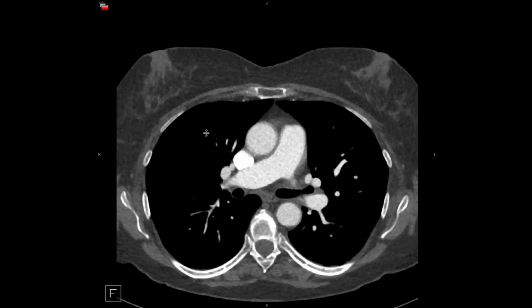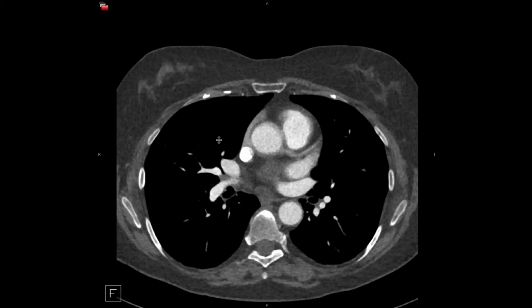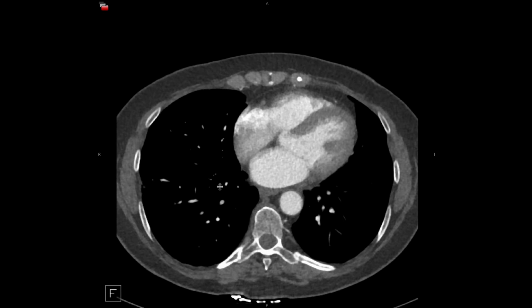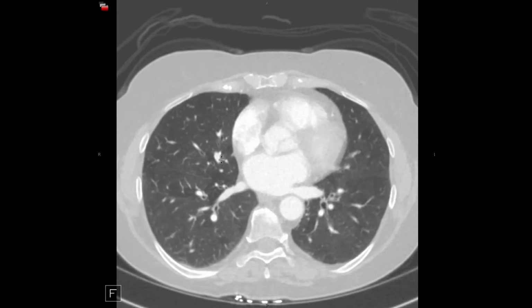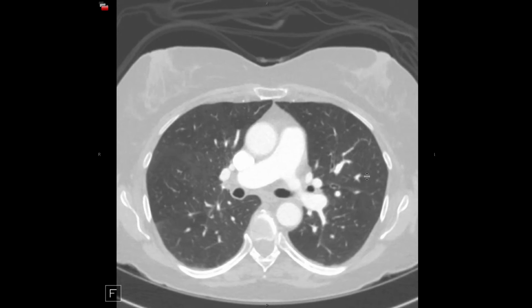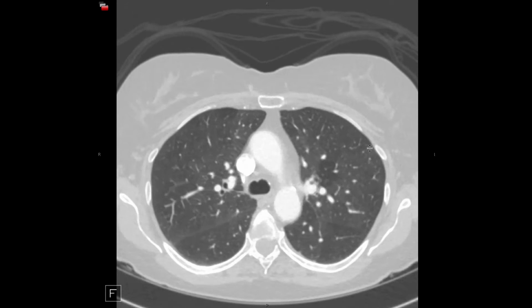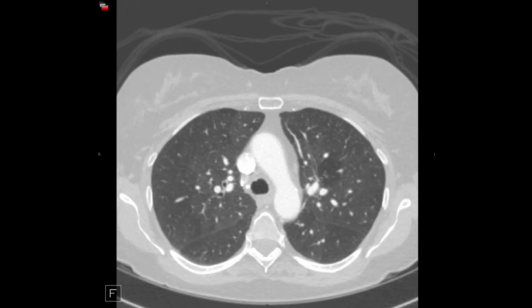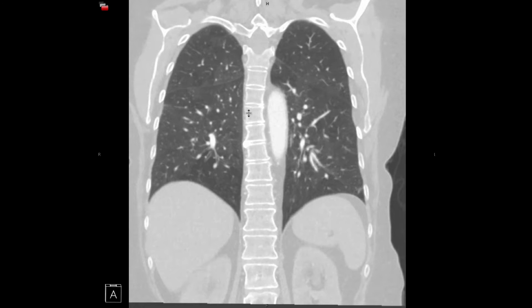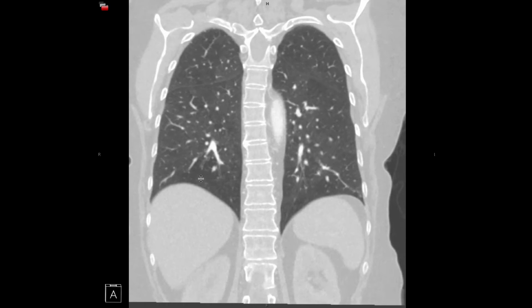And you can see that essentially the pulmonary emboli have resolved. We don't really see any residual filling defects, like there's some lymph nodes here next to the pulmonary arteries, but no convincing filling defects. However, we look on the lung windows, we can see pretty extensive mosaic attenuation as we scroll through. And there are areas, maybe a little bit more apparent on the coronal images here, there are areas of vascular pruning and or at least vasoconstriction.